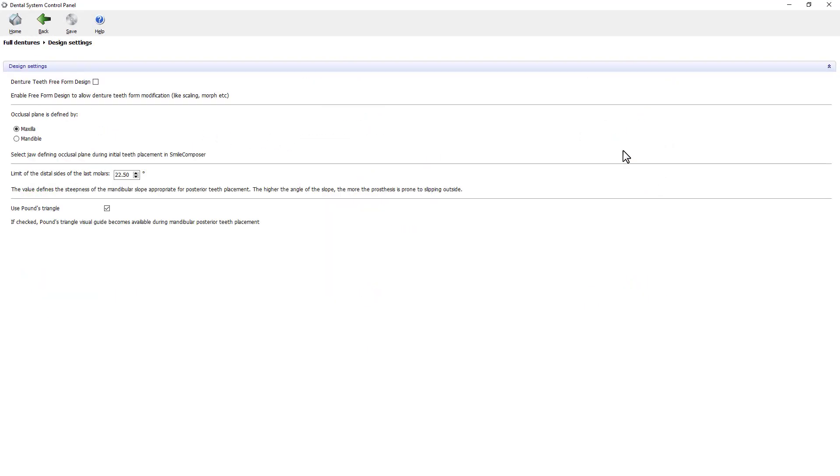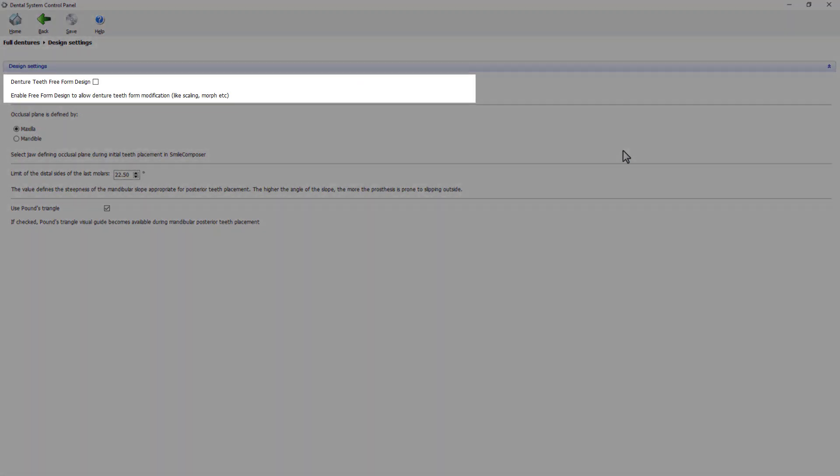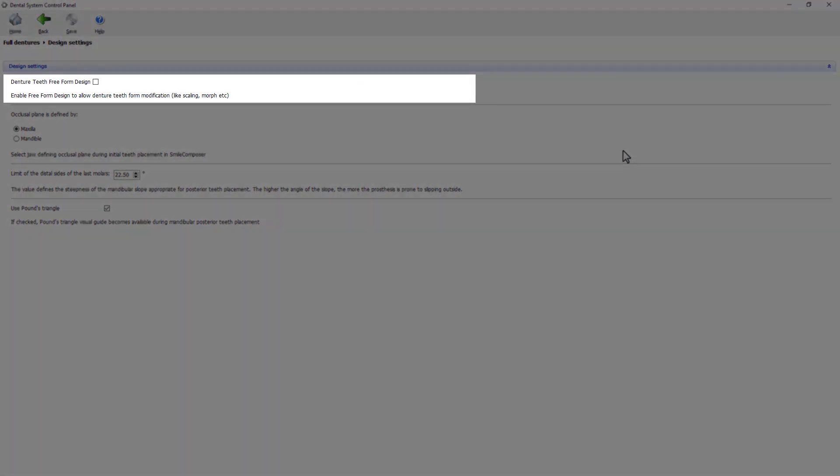You can see that there are a few options here. Firstly you have a checkbox for denture teeth free-form design. If you're going to enable it, that means you will be able to change the teeth shape. You'll be able to use more specific tools while designing in the dental designer.